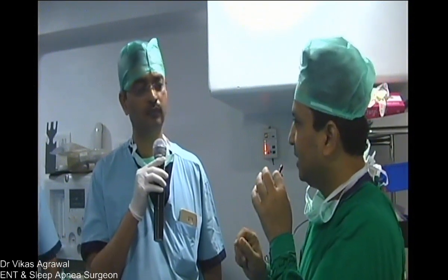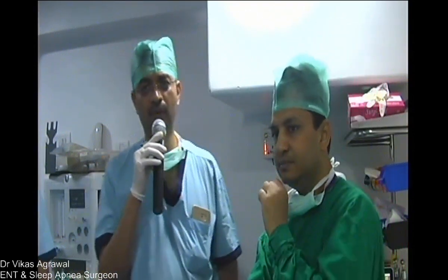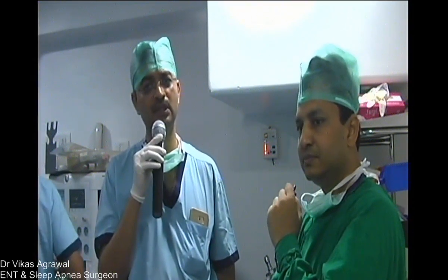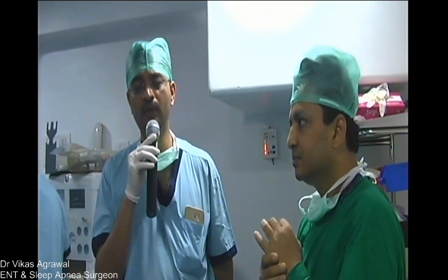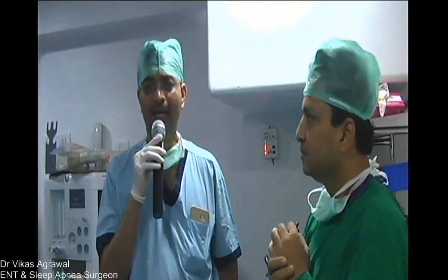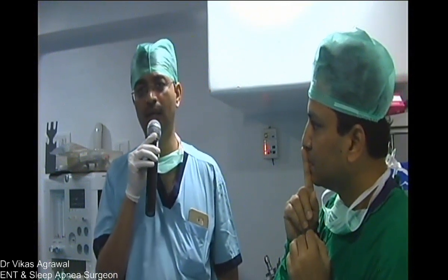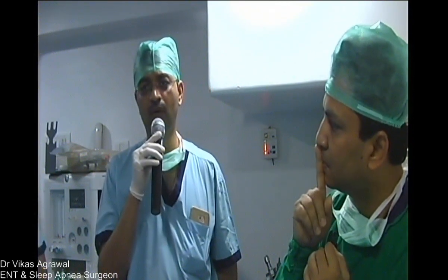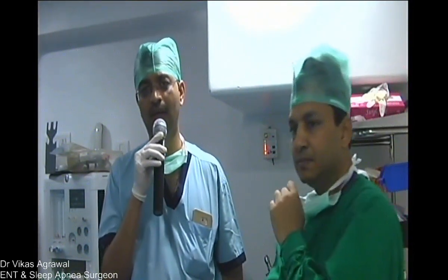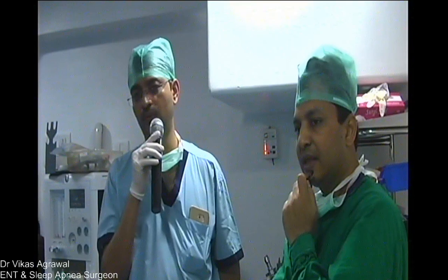Correct. And then, to visualize the larynx, ventilation is fine. Now, when you intubate, how important is the laryngoscope that you use? This is a very important question Dr. Vikas has asked about. The whole situation of intubation depends on video laryngoscopy. We have been using our conventional laryngoscope since long, where the laryngoscope light is quite far away from the tip. So whenever we are looking at the vocal cords, we are not exactly in the angle. So what we normally do in laryngoscopy is try to get all angles, all axes to match in one direction by manipulating the patient's mouth, neck and shoulder, and then we try to intubate the patient.